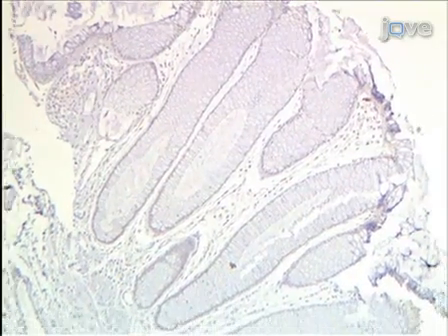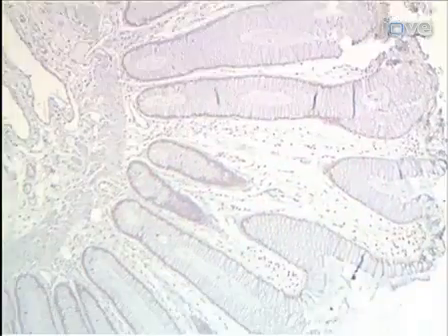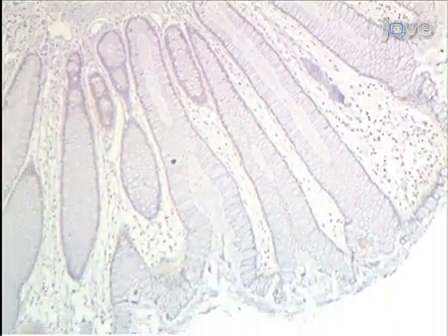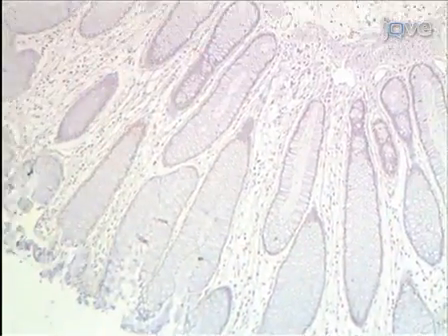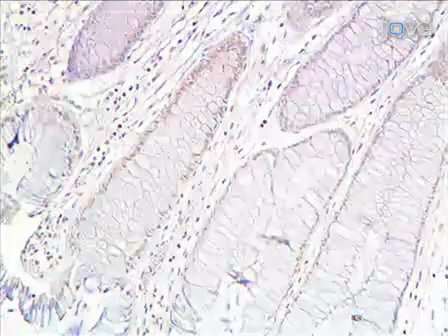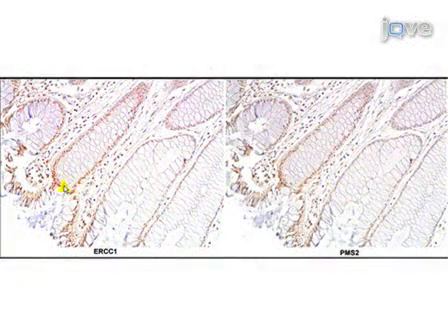Here we have a second sequential cut tissue section near a colon cancer, immunostained for Pms2. As we move through this tissue section, the crypt, which has stained for ERCC1, has also stained for Pms2. At a higher magnification, we see high expression of Pms2 in the same crypt. Here both crypts are paired.